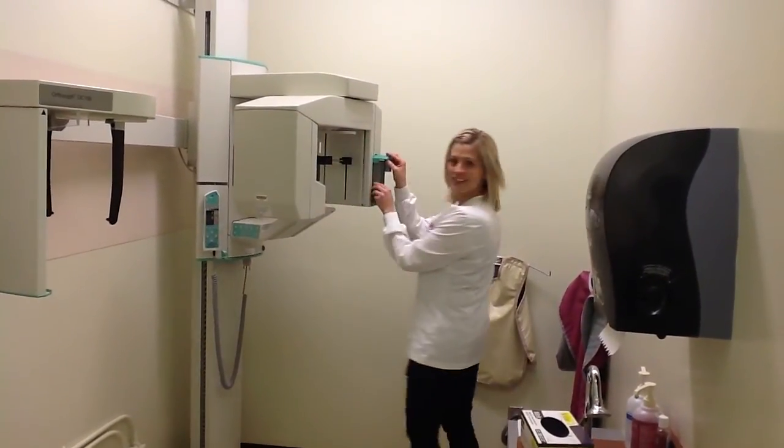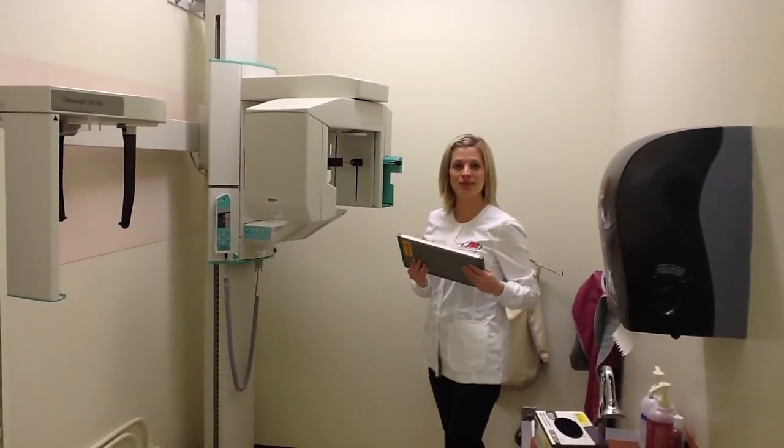Okay, to remove our cassette, we're going to remove our cassette and we'll take it to the processing area.